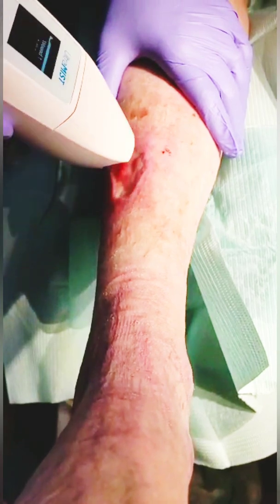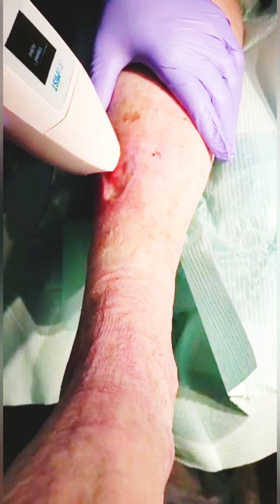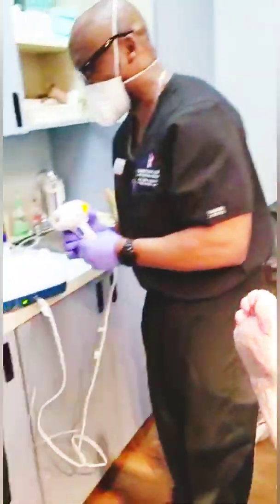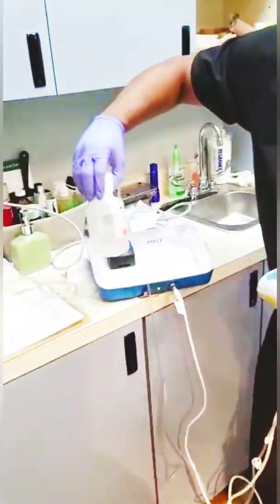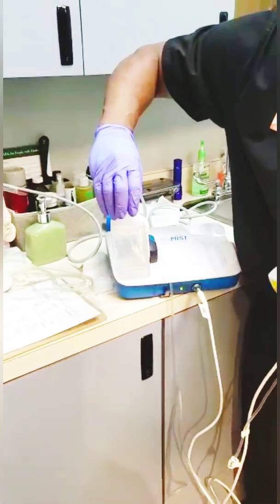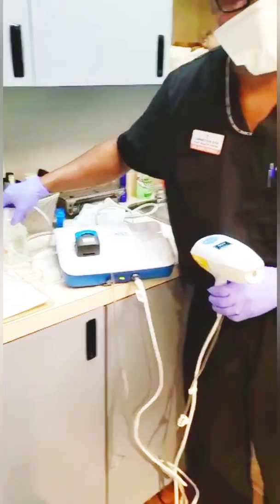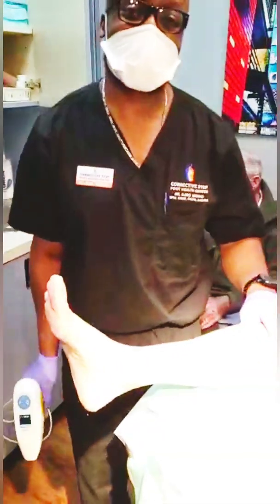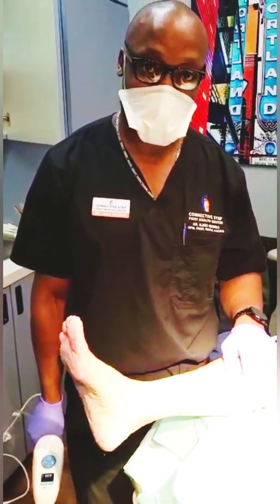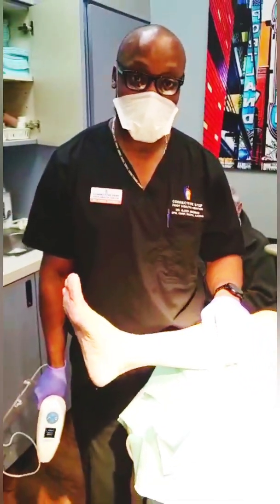We have about 10 seconds left. A couple more seconds and that's done — it shuts down automatically. From what we've used, the saline was full and we used about 72 to 75 milliliters of saline. We're going to dress this wound appropriately with nice compressive dressings to protect the skin as well, and we'll keep you updated. Until next time.